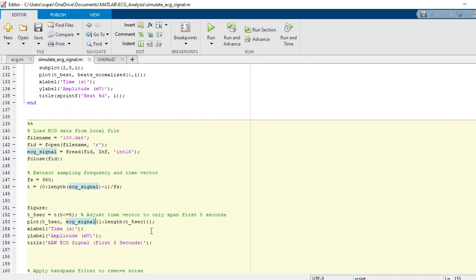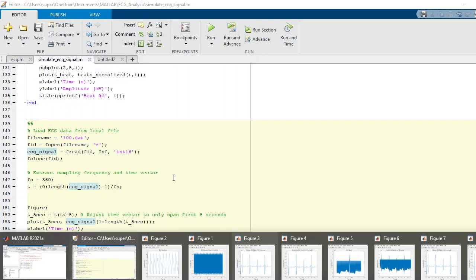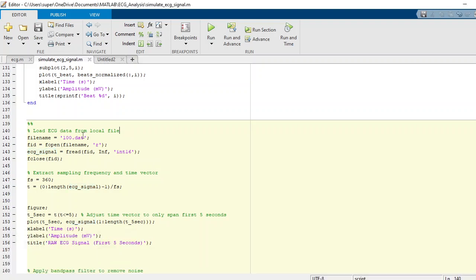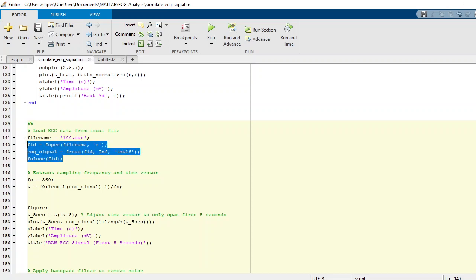After that, I am just reading this with the integer 16 data type and after that I close the file. That's how you will load the data from a local file which is available on the free open source dataset.